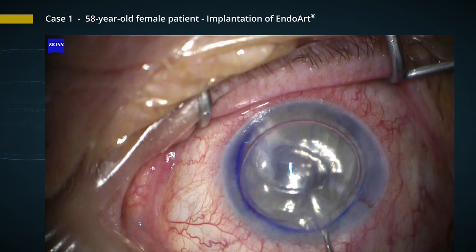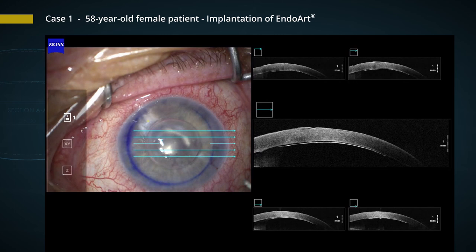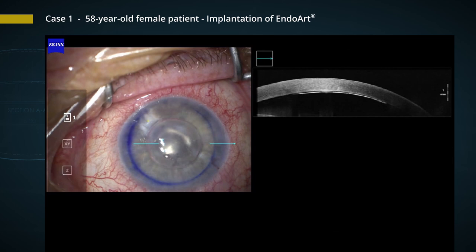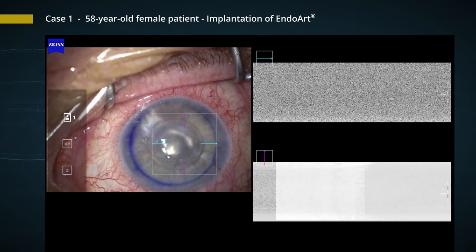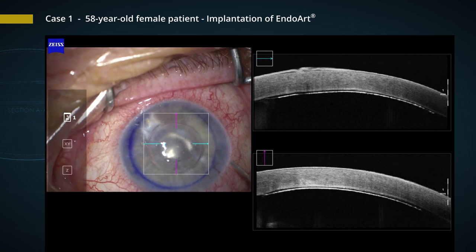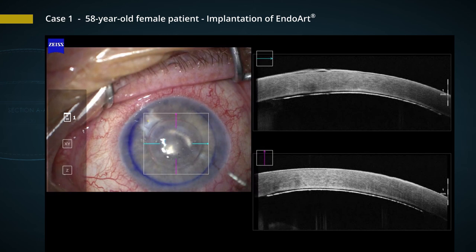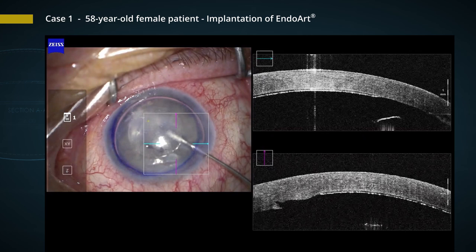We use a spatula to center it. We use the Zeiss Artevo microscope, and now you can see the OCT of the anterior segment, showing very nicely how the lamella fits to the posterior surface. You can also see some remnants of the bullous keratopathy of the epithelium. The implant has attached firmly to the posterior surface, and at the edges of the implant we can see that we have achieved the right positioning. We also put a gas-air combination inside the anterior chamber to firmly press the implant against the cornea.